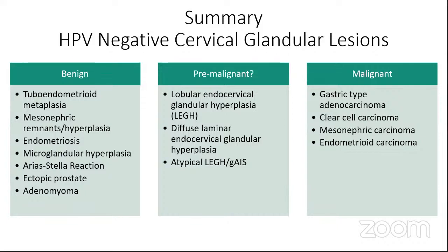Right. So as I mentioned earlier in the molecular genetics of gastric type adenocarcinoma, we found that a small percentage of cervical gastric types have underlying SMAD4 mutations. And I think there's a paper that showed that you can have SMAD4 IHC loss in gastric type adenocarcinomas, although the proportion is much less than in pancreatic adenocarcinoma. So if you do SMAD4 and it's lost, you can suggest that it's pancreatic in origin, but it doesn't exclude that it can be cervical in origin, unfortunately.